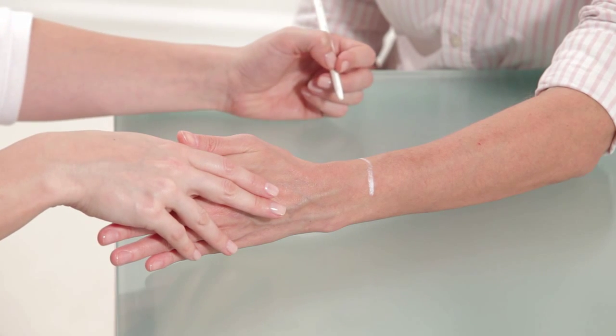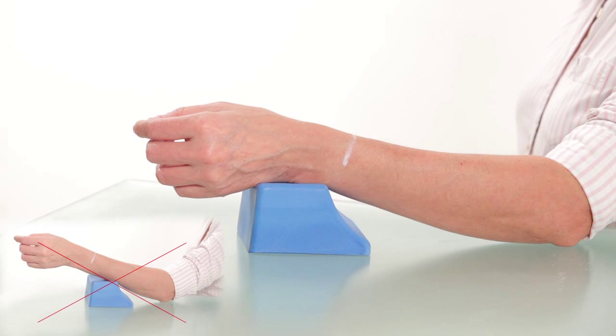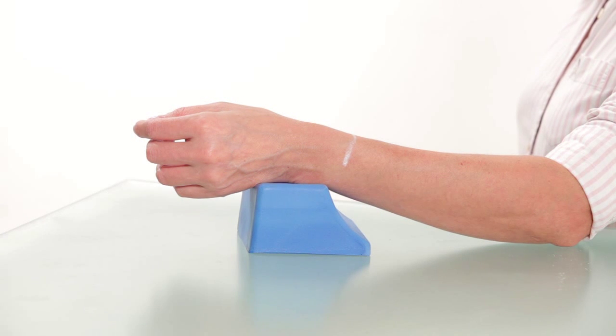Measurement should be conducted next to the line. Place the subject's forearm parallel to the desk, but keep the lateral surface of the hand resting on the handrest, so the wrist is slightly raised from the desk. The subject's palm should be open and the fingers relaxed.